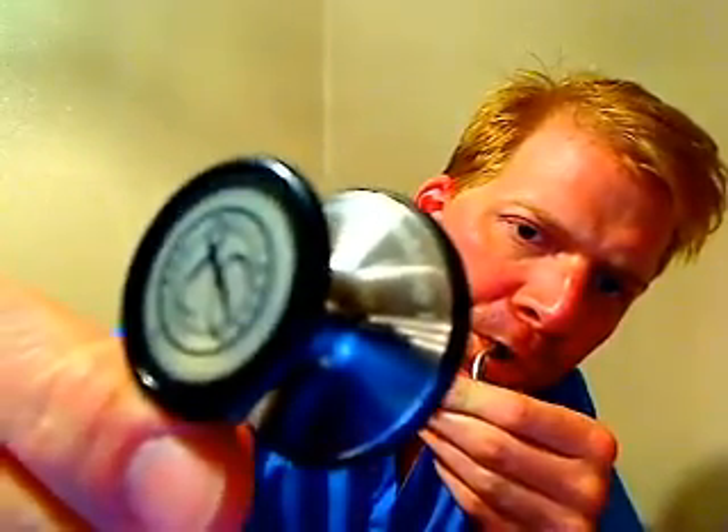I actually have two Littmann Cardiology III stethoscopes because I think they're awesome and reasonably priced. This one has the problem too, if I remember. Cover one ear tube and blow. You hear that noise — you shouldn't hear that. Whereas if you listen to the diaphragm side, I think that diaphragm is working. No noise at all.